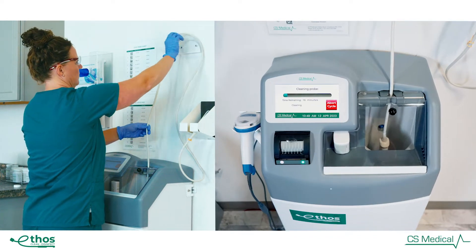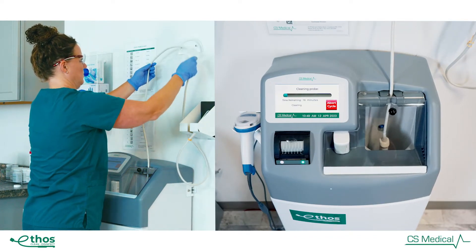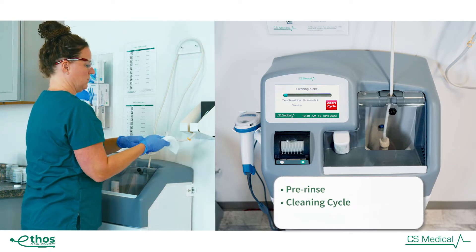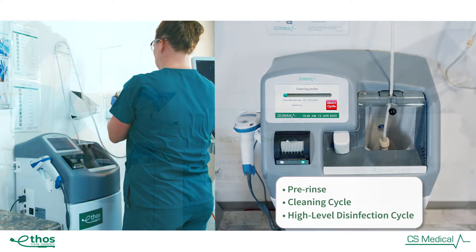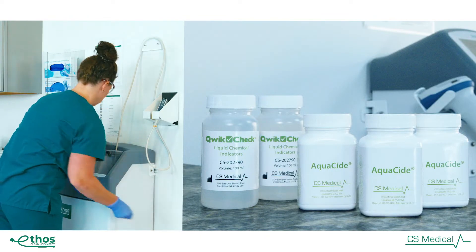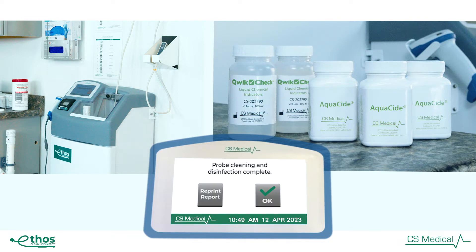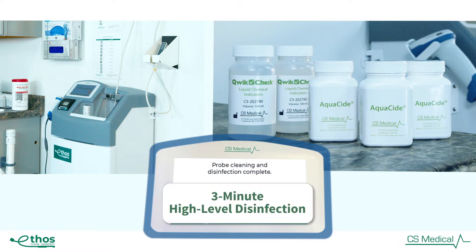Once the end user has placed the soiled probe into Ethos, it receives a pre-rinse, followed by an active cycle to clean the probe prior to the high-level disinfection cycle. The combination of Aquacide high-level disinfectant and the QuickCheck automated chemical indicator ensures that the high-level disinfectant has the correct concentration to complete the high-level disinfection in just 3 minutes.